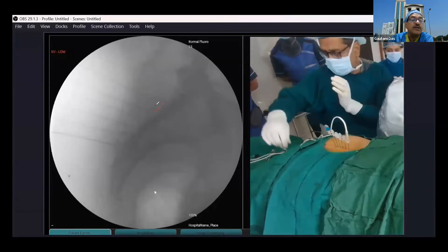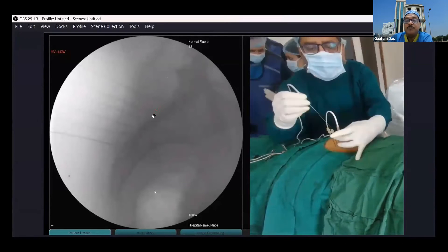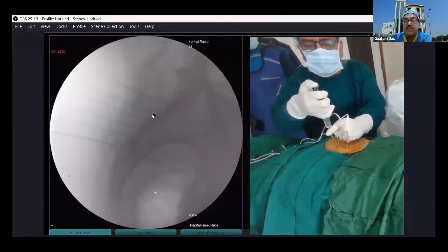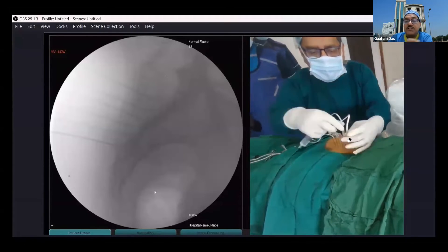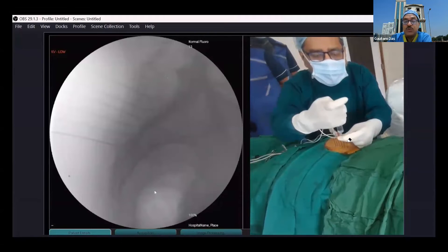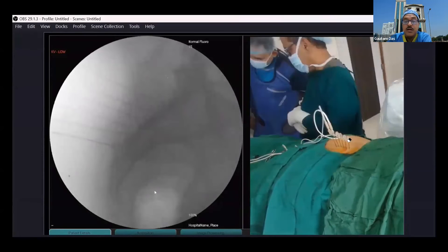After correcting the needle placement, we go for the stimulations. After doing the stimulations, we perform the lesions — strip lesions continuously one by one. This patient was having bilateral pain, so after completing one side, we give a little bit of steroid injection and then go to the other side. We are doing bipolar lesions here. Bipolar lesions have the advantage that you can do two lesions together and create a larger strip lesion. For the sacroiliac joint, either bipolar radiofrequency or cooled radiofrequency is recommended, as both can create a large size lesion.